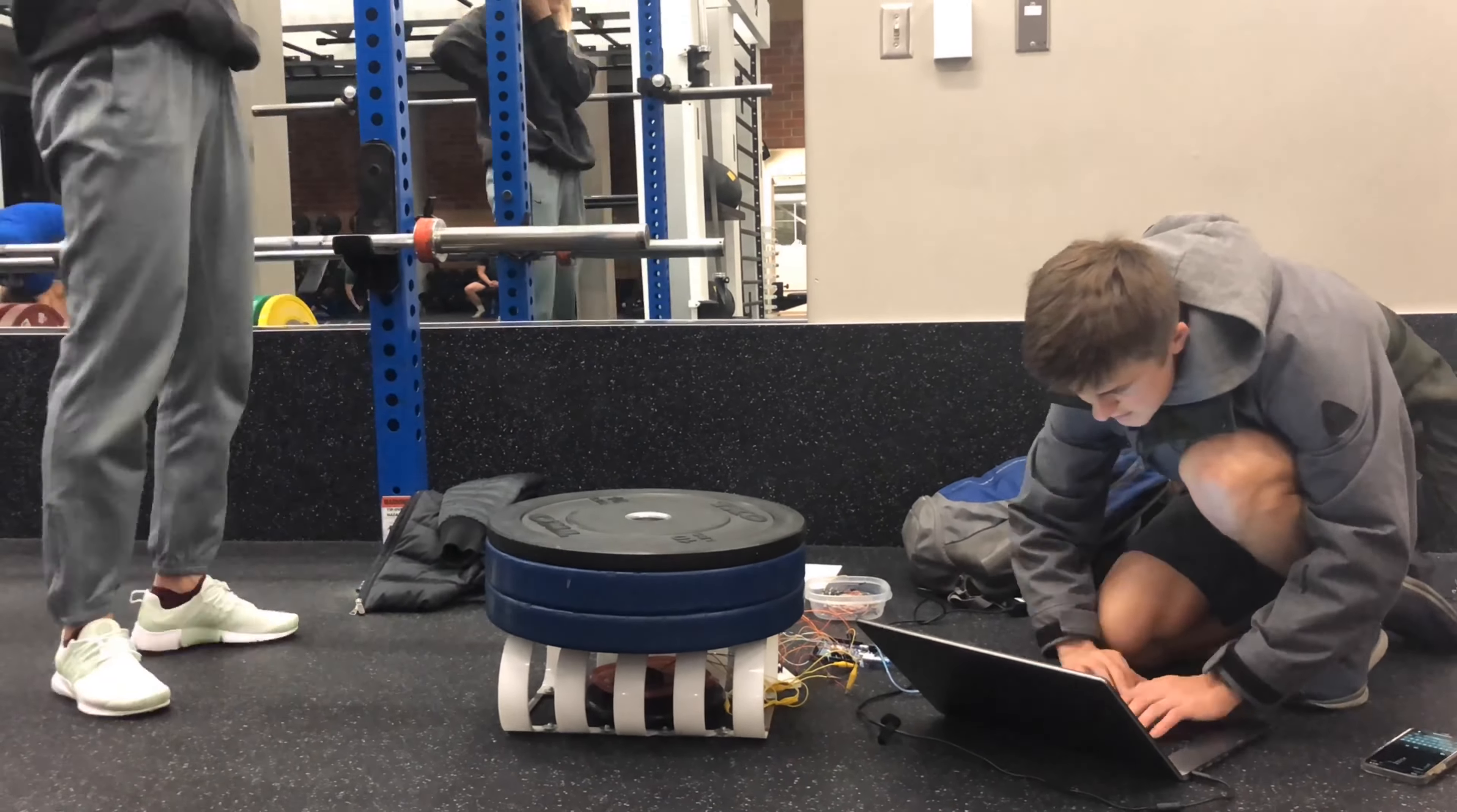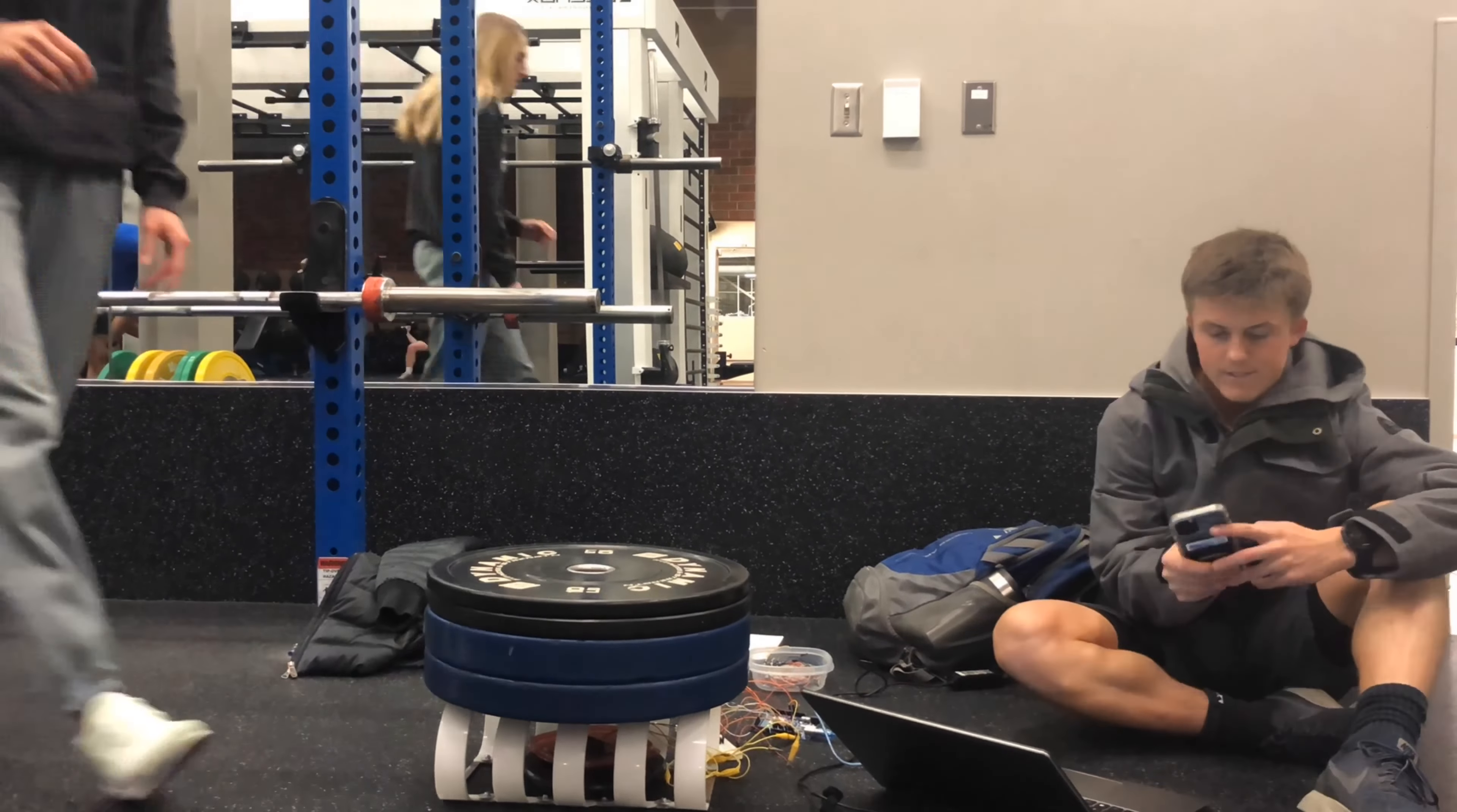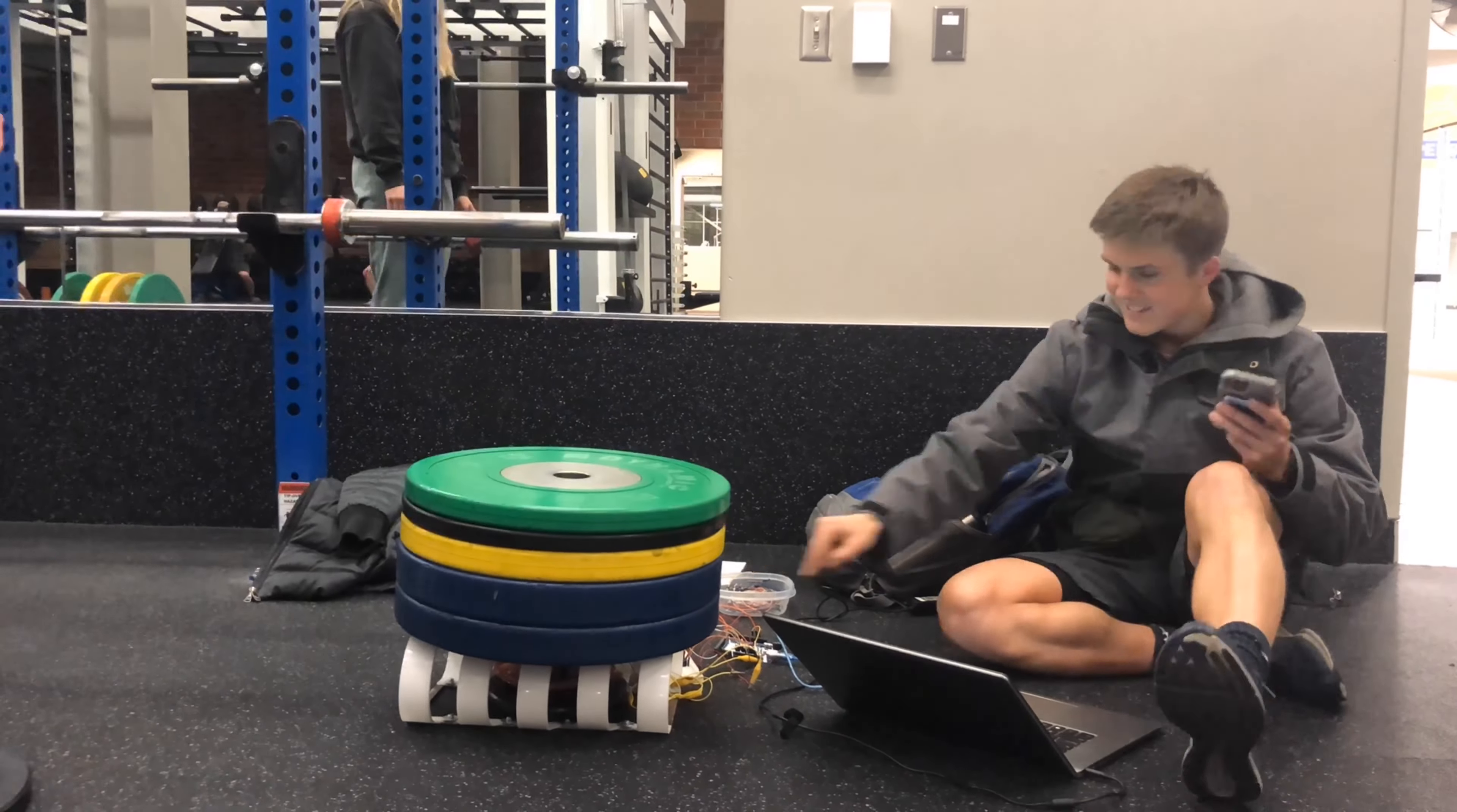Here is the strength testing of the ribcage. It took 125 pounds to compress at 2 inches and 150 pounds to compress at 2.4 inches. The feedback system was coded accordingly so that the force measurements would follow American Heart Association guidelines.